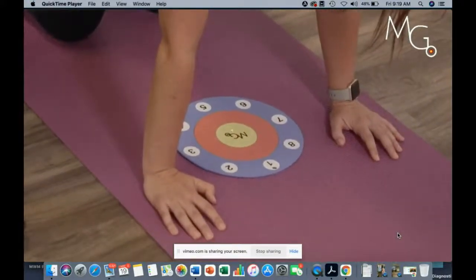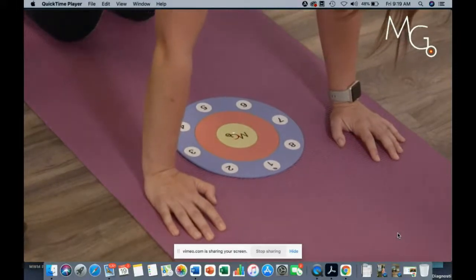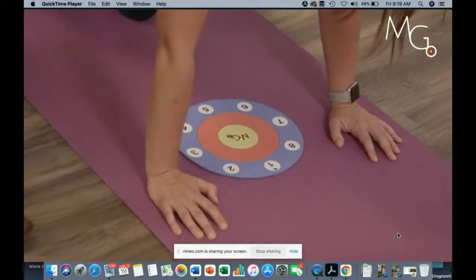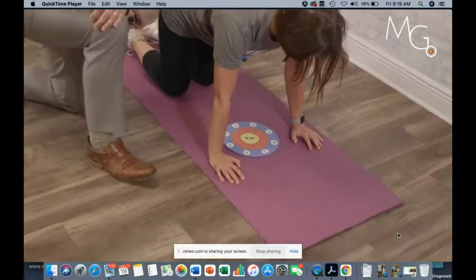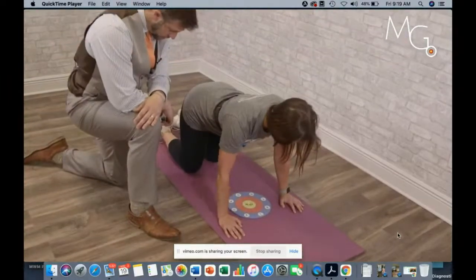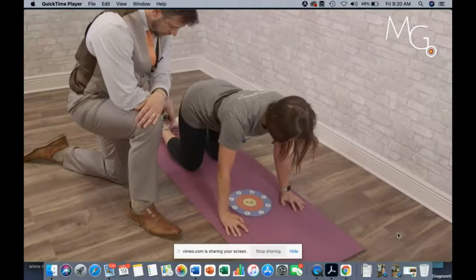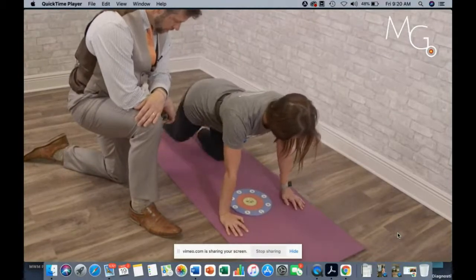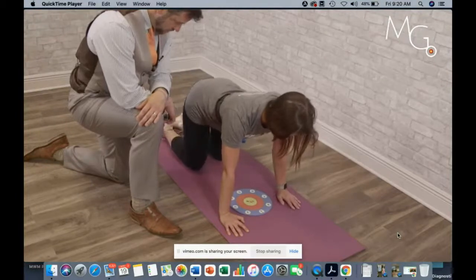This is a super common exercise for shoulder dysfunctions, for trunk dysfunctions, for concussion things, putting people in a positional challenge for regulatory systems by being horizontal instead of being vertical. You can train those people here, maybe even a POTS-related disorder or something like that.